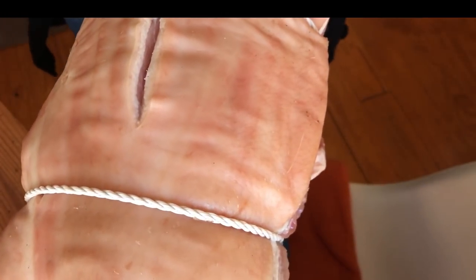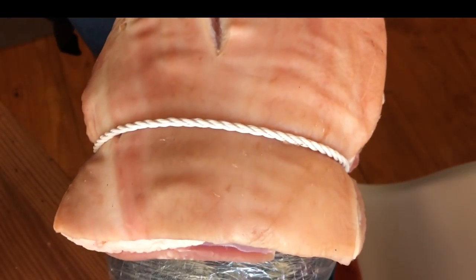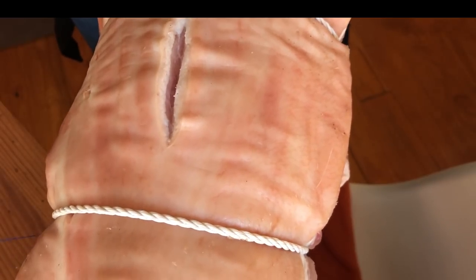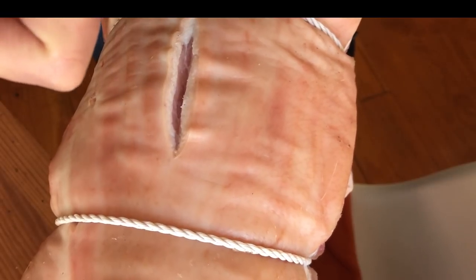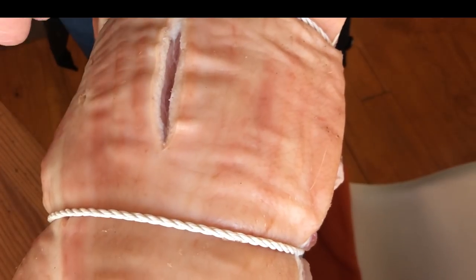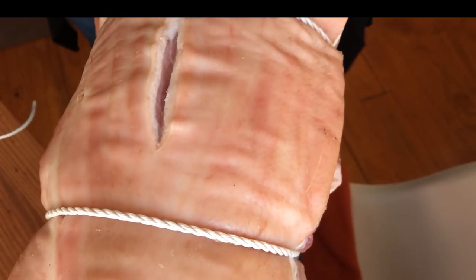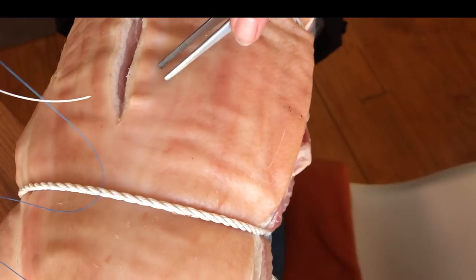So I've got myself here a surgical needle and the instruments, as I'm going to be posting quite a number of videos on how to, so that you can look at that, and I'll tell you exactly what to do and where to get it, etc. So according to the videos, you grip it a little way in there, and you can see I've got myself a nice big needle. In the demonstrations I have small little needles, which I think is going to be a bit of a hassle.